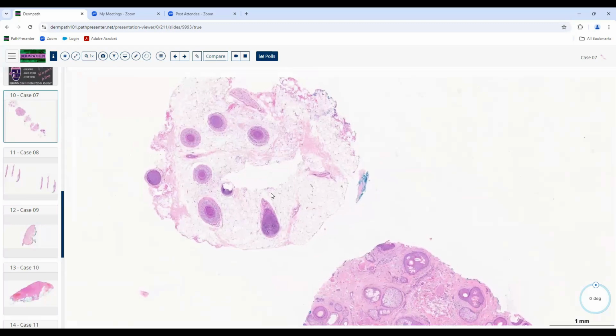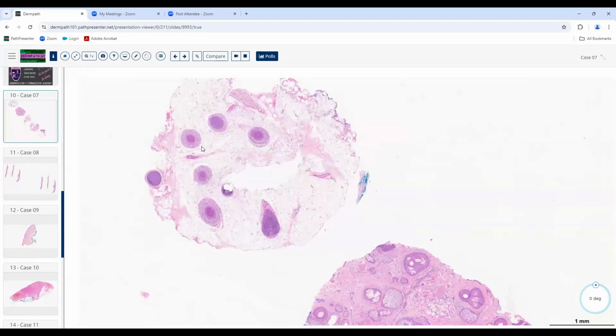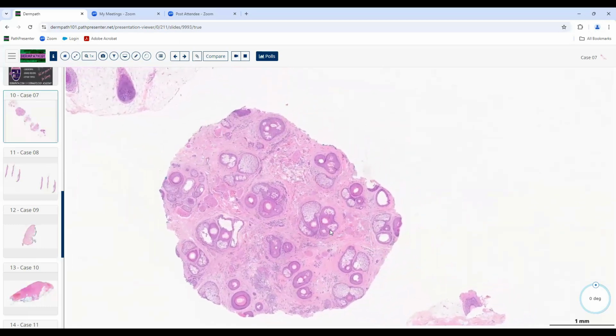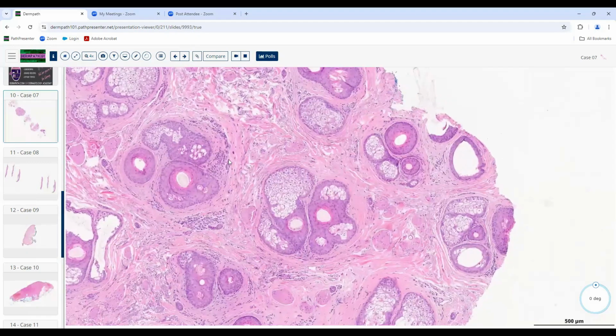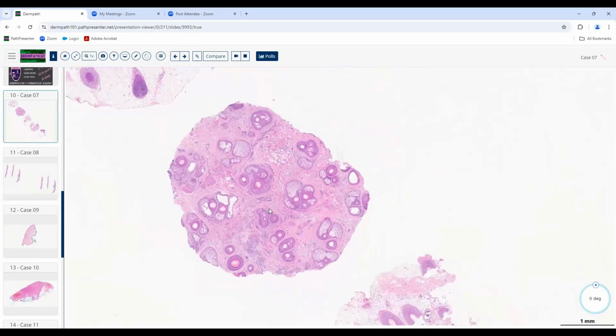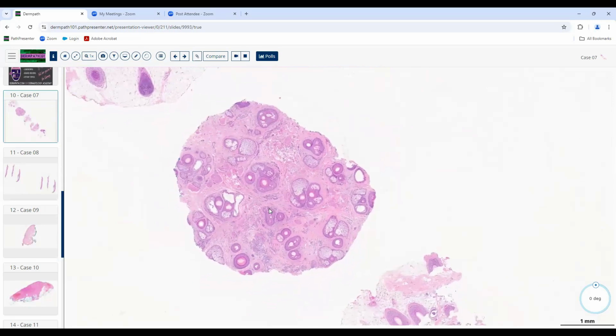And so if we were to look over here, this is down in the subcutaneous fat. And so normally we should see about 20. Well, we see about half that number. So we know this person's got an alopecia. We don't see any perifollicular fibrosis. We don't see any significant inflammation here. So this is a classic example of androgenetic alopecia.